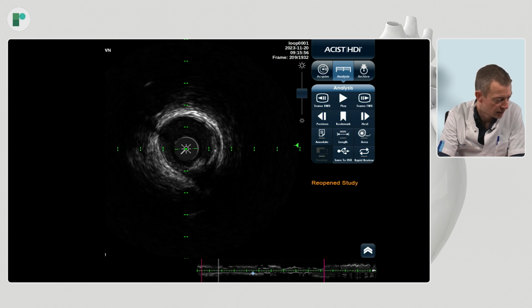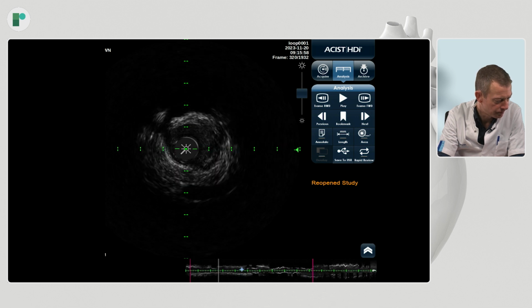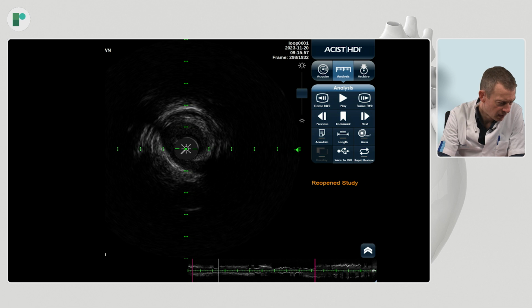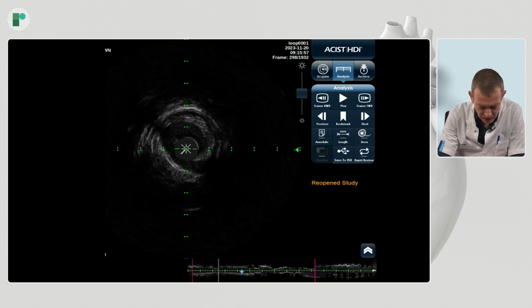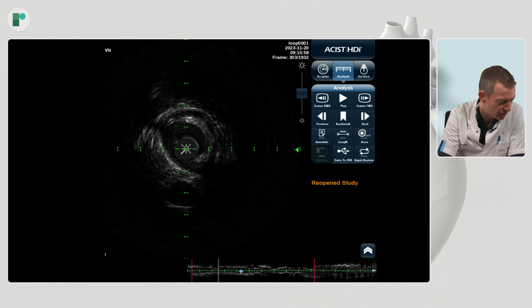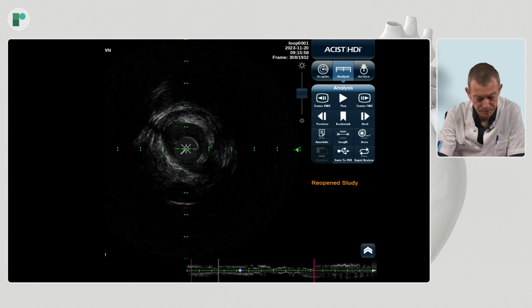Now here again, see healthy. Here again, a lesion. And this is interesting because here we start arriving at an area where we know there is significant luminal narrowing. And if we look here at the stenosis, we are still past the diagonal branch. Please recall, I put two wires. I put one wire in the LAD and one in the diagonal. You will see why that is handy.